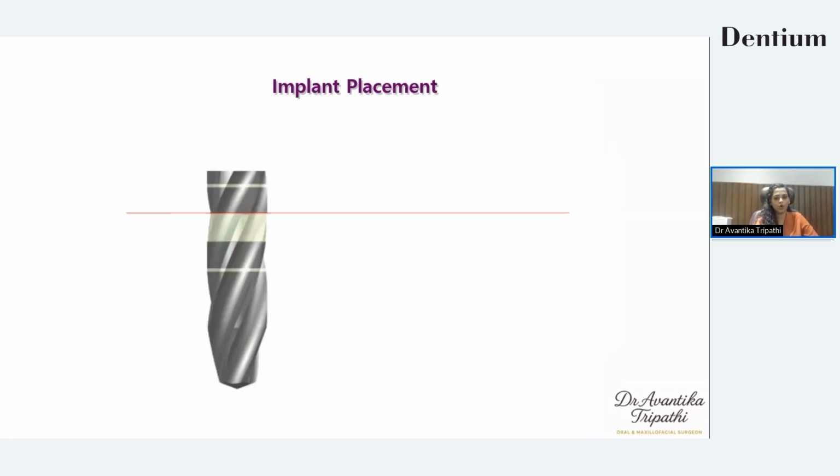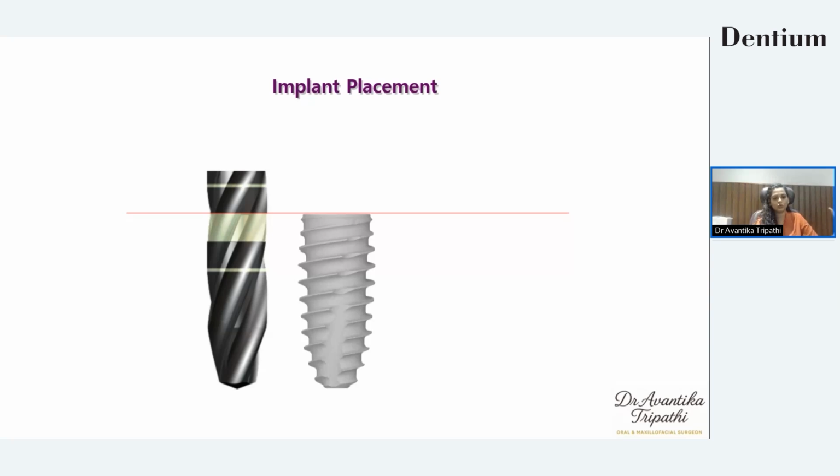We always have to be very, very sure that if I have drilled till 11 or 13 mm, then my implant will also go till 11 or 13 mm only. Till the depth of the drilling an implant can go, it cannot go beyond that.